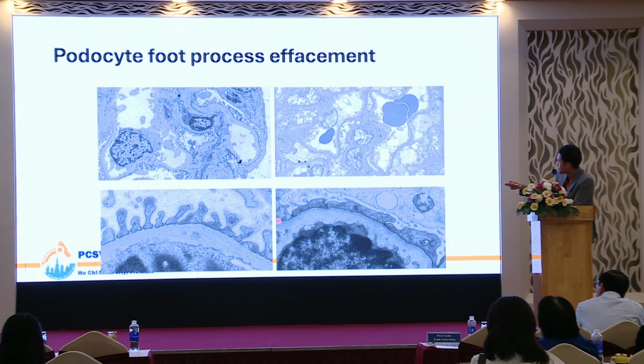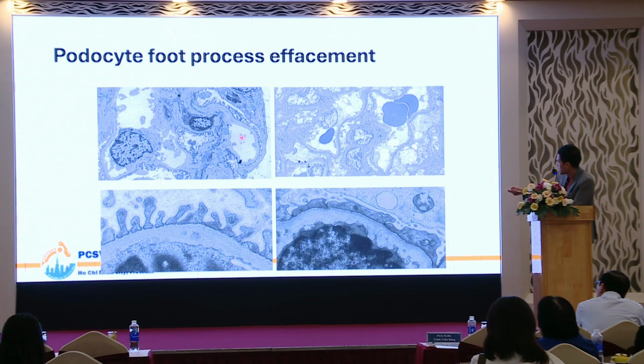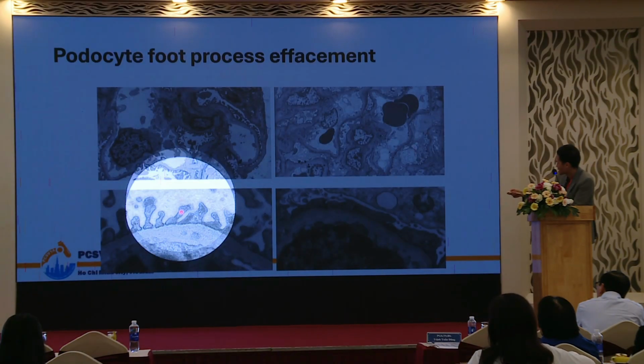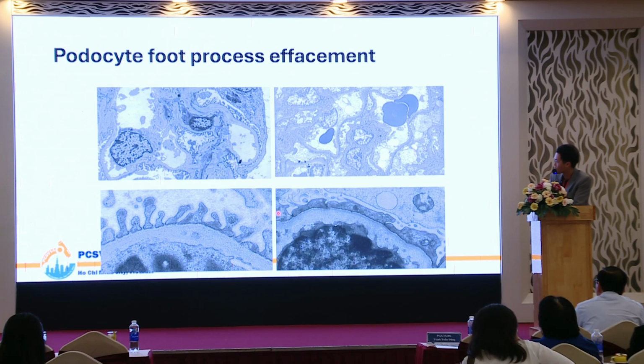So some of these podocytes are fused or effaced. The filtration barrier is lost. So for podocytopathy or primary podocyte disease, almost all podocytes show this effacement, but in secondary change in podocyte or secondary damage to the podocyte, only a portion of podocytes look like this.